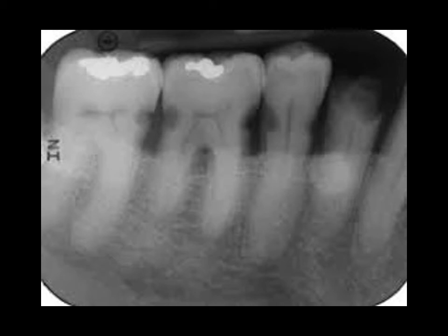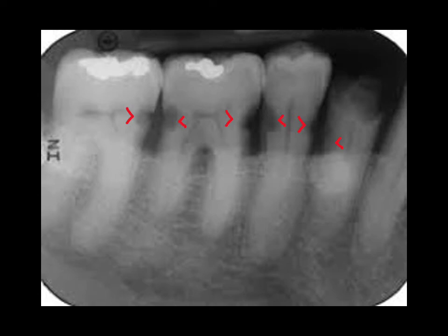Here's somebody with significant root surface decay. We can see it on the mesial of number 31, the mesial and distal of 30, the mesial and distal of 29, and maybe the distal of 28. If we see this on a radiograph, we'd attempt to feel it with our explorer, but often the proximal contacts are such that we cannot get an explorer in there, and we have to rely on our radiographs for interpretation.